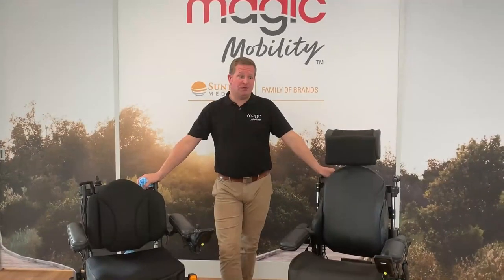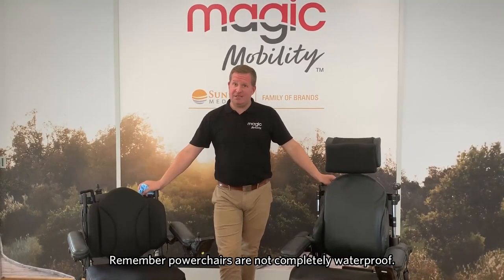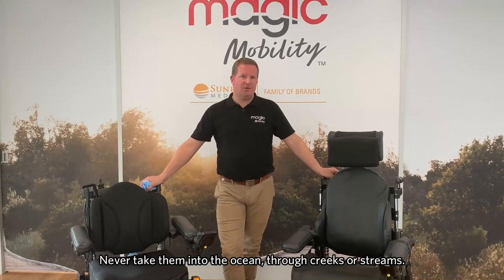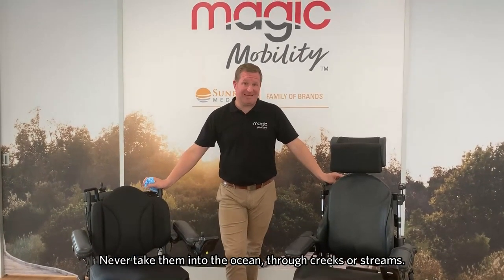Finally, a reminder that because of the electric components in the chair, these chairs are not completely waterproof. Please don't take them in the ocean, through creeks or streams, and try to reduce the risk of the chairs getting excessively wet.